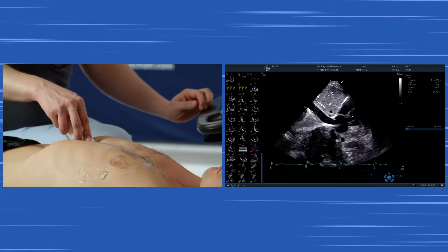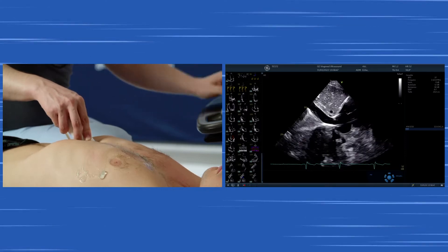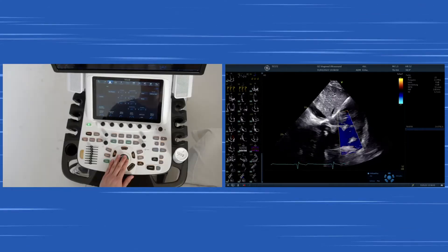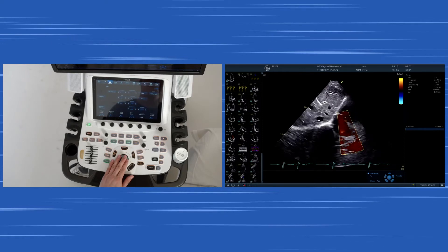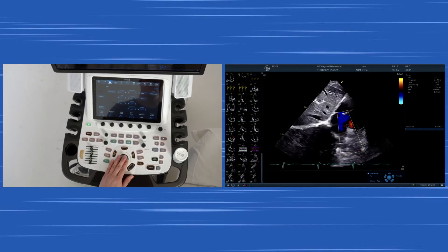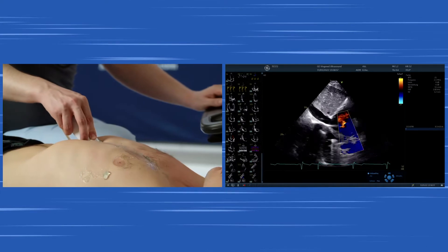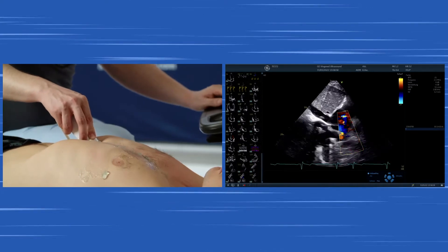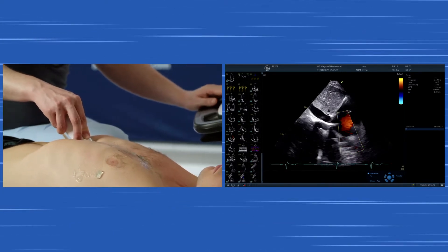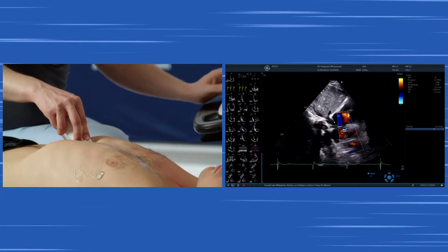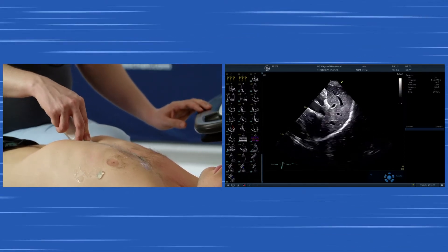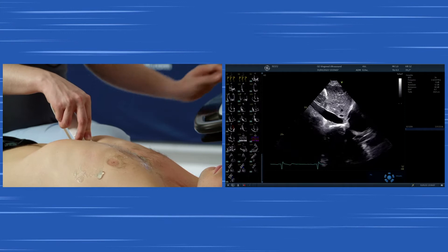Here we can see the IVC entering the right atrium, and we can also try to locate the SVC as well. It's not always simple, but normally the SVC is a continuation of the IVC, so you can try to achieve this view from a subcostal approach.